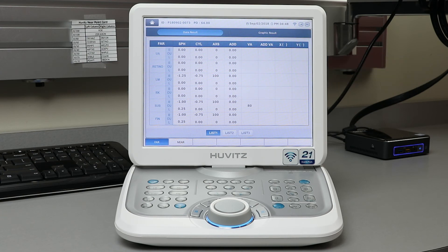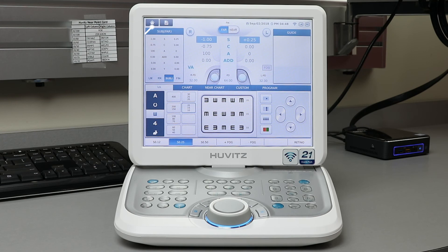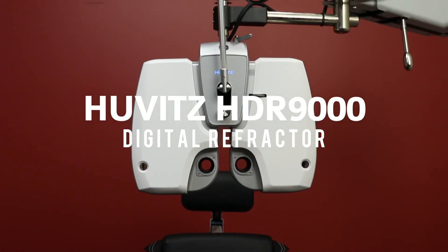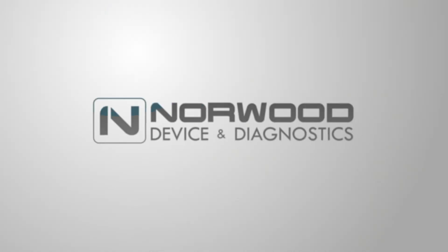In the top left corner, you can press the Home icon to go back to your main screen. On the keypad, press Clear, and then you can start a new examination. The Hoovitz HDR9000 Digital Refractor — one of the many great products from Norwood Device and Diagnostics.